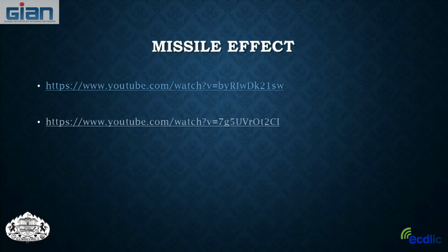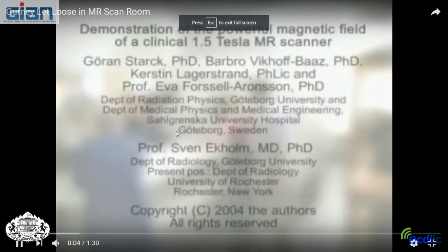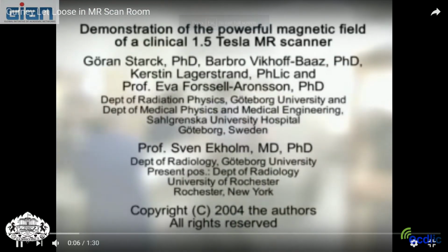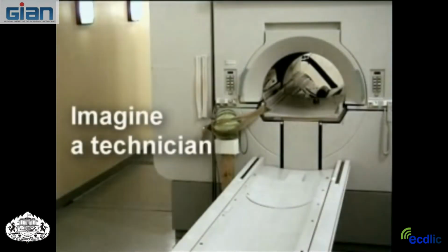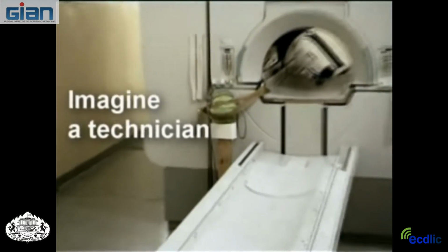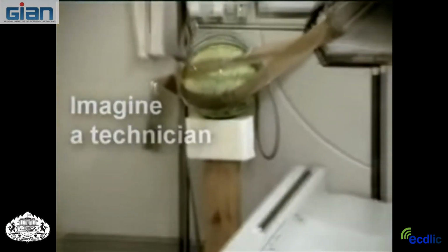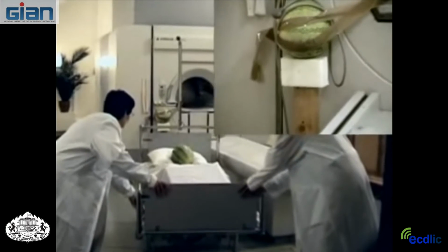Okay, so I'm going to show you some videos of this missile effect, and let's see. I think one you might have seen at the break. Let's see if this one's going to load. Okay, so this is a 1.5 Tesla magnet. So we use a magnet that is twice as strong as this in our scanning. So watch what happens here. So they have a watermelon here.